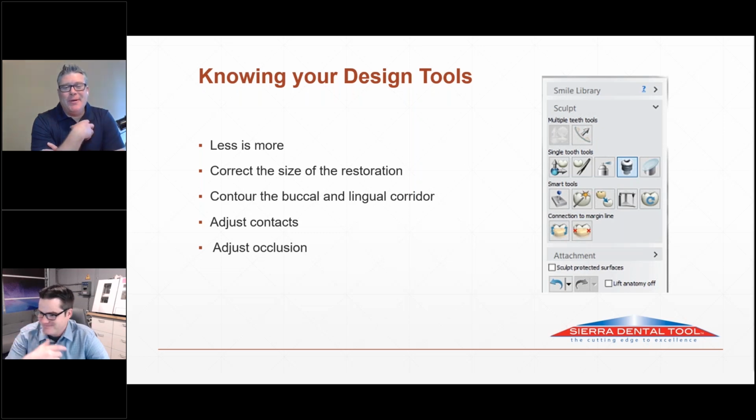So this is where it gets a little different for me, because I grew up with my hands on every single case. I actually purchased what they call a 3D connection mouse, which allows the model itself to move in one hand and your working instrument to work in another one. And that kept my efficiency very high. On a regular day, I was doing between 60 and 80 designs in a day. That's not scanning. That's just working through the designs.